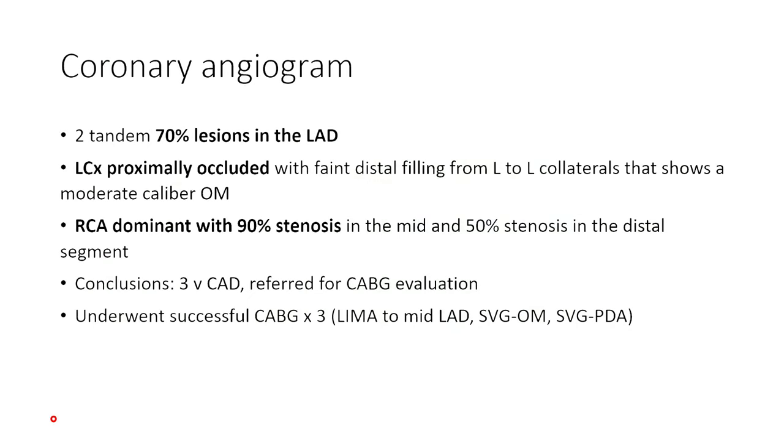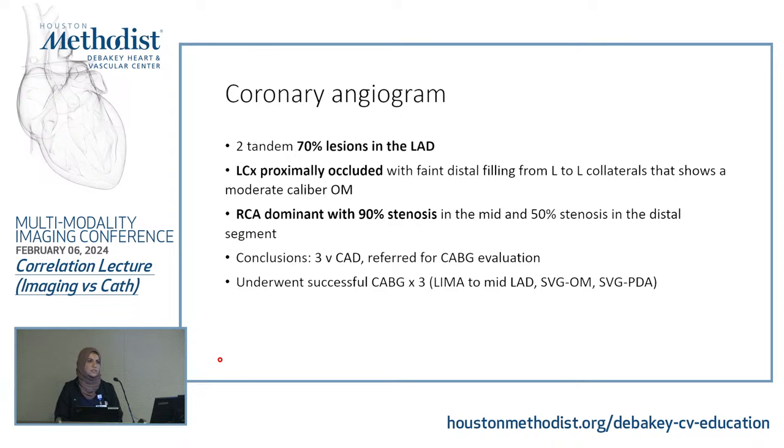I'm going to move on to my next case, but just summarize the take-home messages: incorporate all the data, look at your flows, look at the EF between rest and stress, look at your calcium score, the TID, and incorporate that with your reading. That may change things. This patient changed from single vessel disease to multi-vessel disease based on those findings.